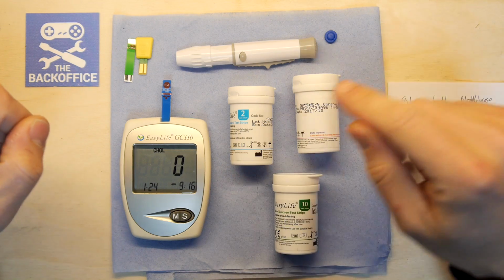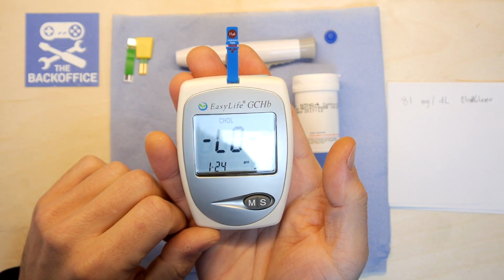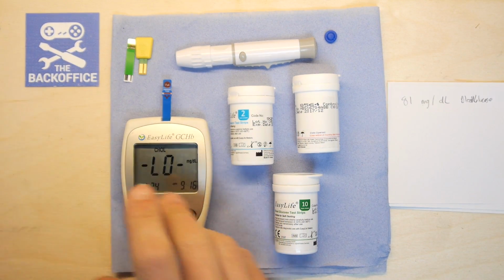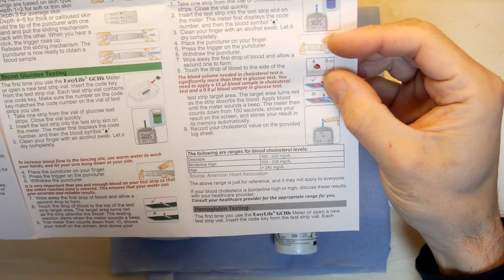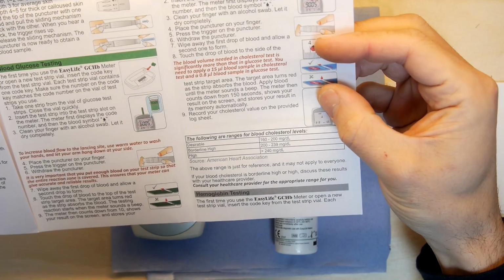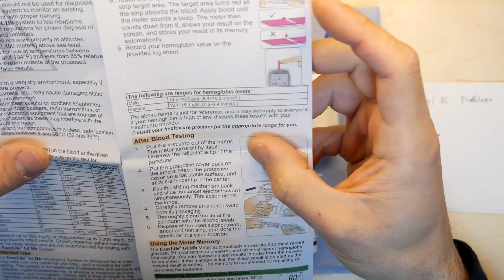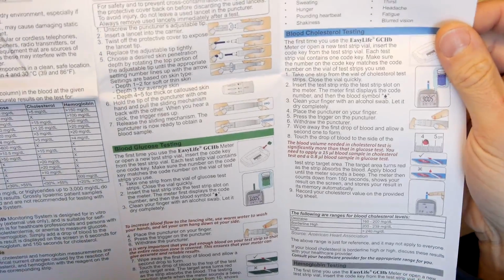So... oh, we're nearly there. Right. What does that say? Low? What does low mean? You need to burn the cholesterol test and... okay. Just yeah, that's pretty disappointing. It's not telling me what low means, so I don't know. Maybe I just didn't have enough blood for that test, which is kind of annoying.